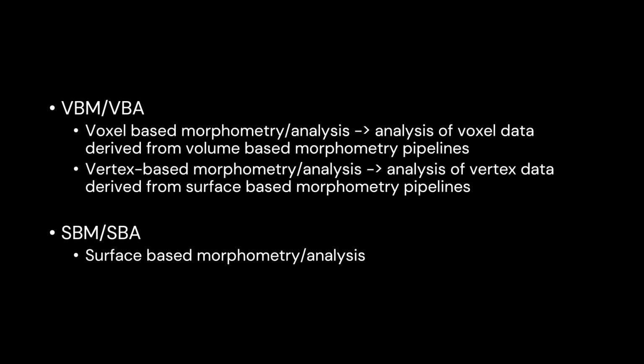If you're talking about vertex-based analysis or vertex-based morphometry, the author is probably referring to metrics derived from the surface-based morphometry pipeline, such as FreeSurfer. So if you do group analysis in FreeSurfer, the term we use is vertex-based analysis instead of voxel-based analysis, because the reconstruction of FreeSurfer is into vertices, not into voxels. With SBM and SBA, it's just as the name suggests, surface-based morphometry and analysis. Those are the characteristics that make FreeSurfer so special.